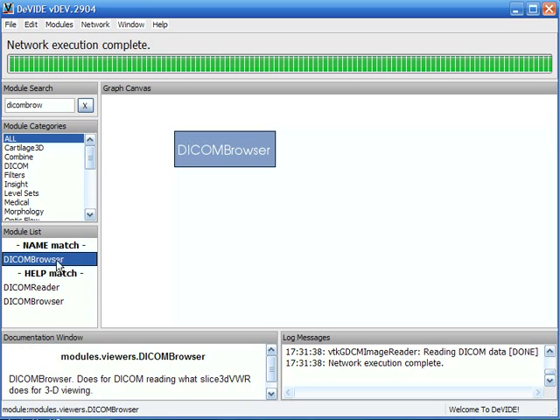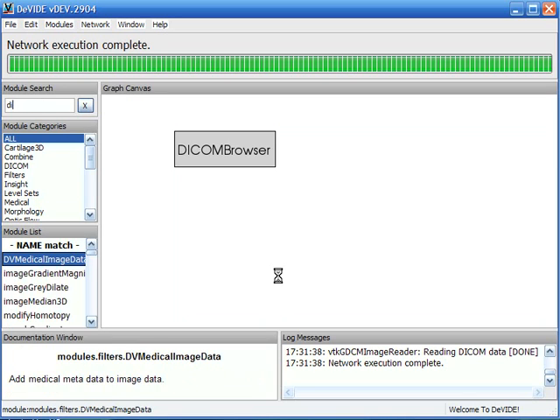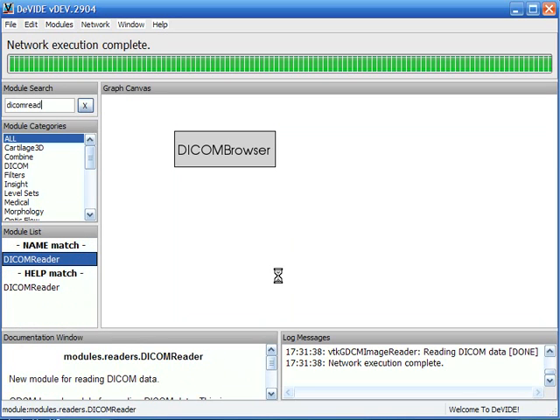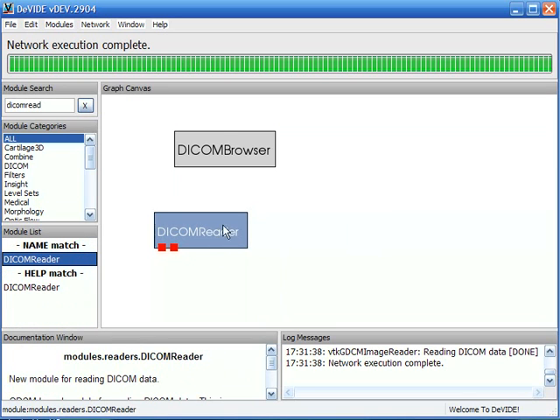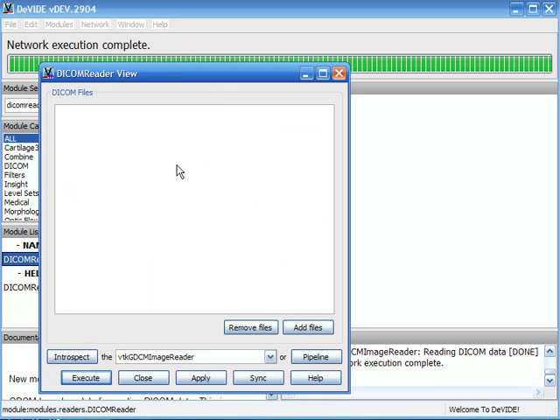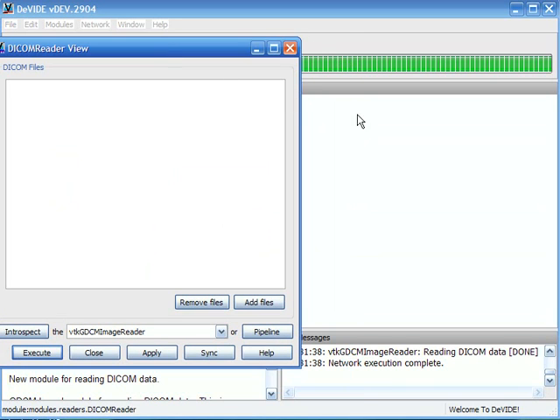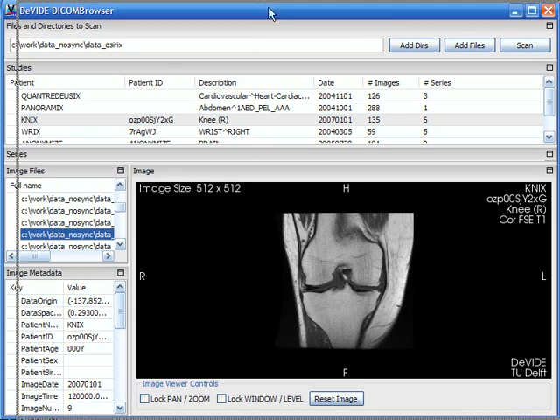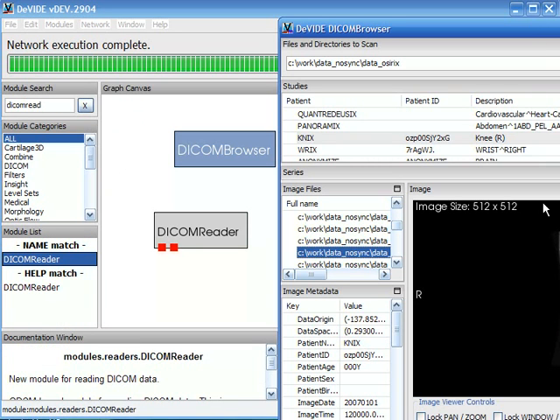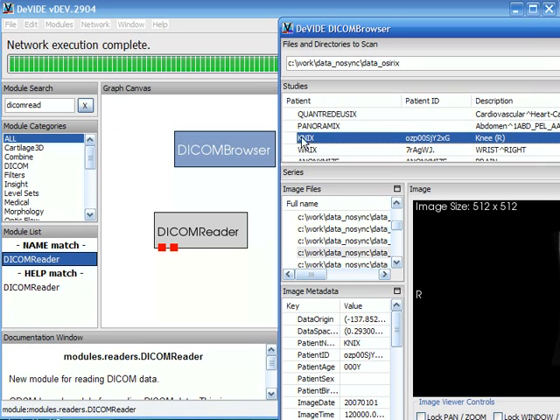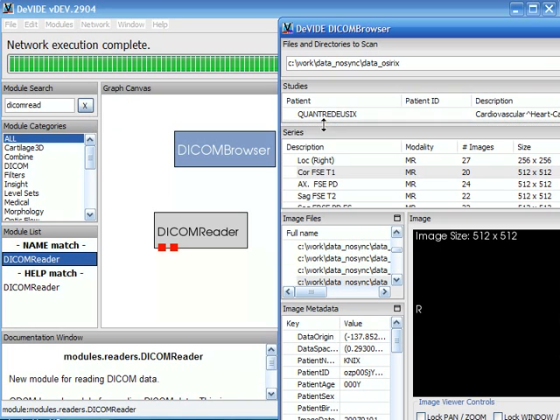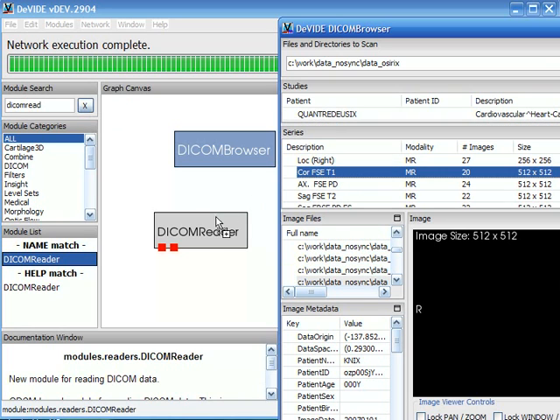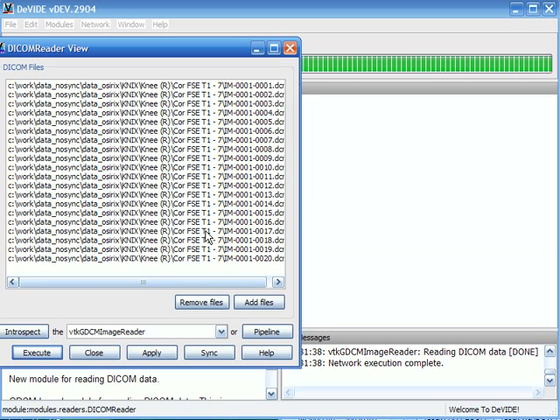I can use a DICOM reader for that. See empty list box that should be filled by DICOM file names. Let's just drag that whole series by selecting it over here. Oops not there I mean here of course dragging the whole series and dropping it on the DICOM reader and you'll see it's now automatically been filled by the file names which are part of that series.